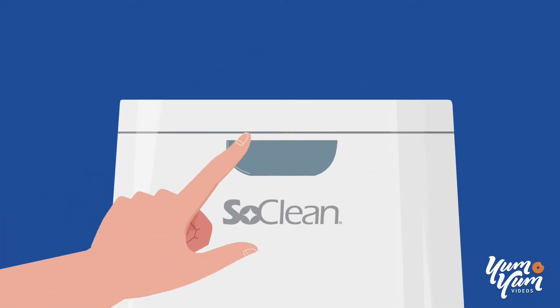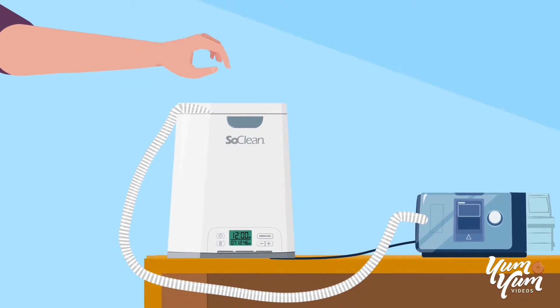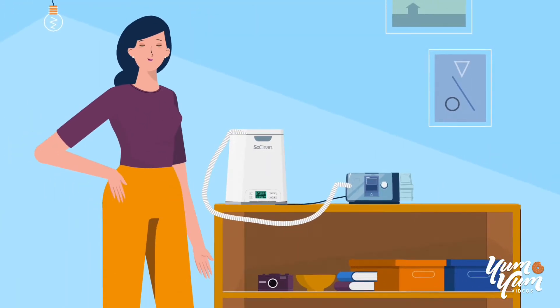All you have to do is open the lid, place your mask inside the chamber, and close the lid. That's it. Well, at least for you.